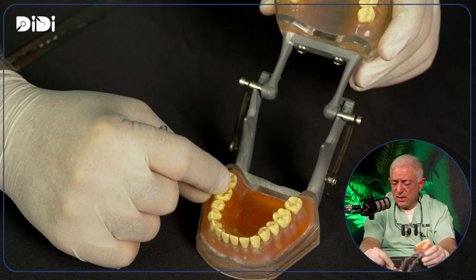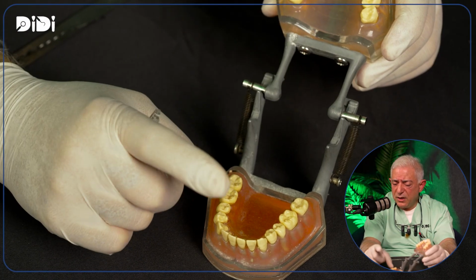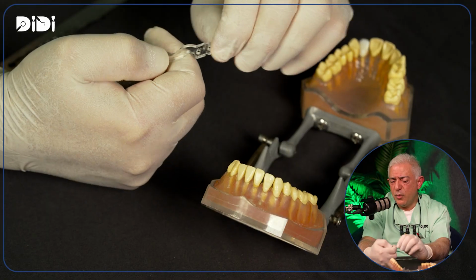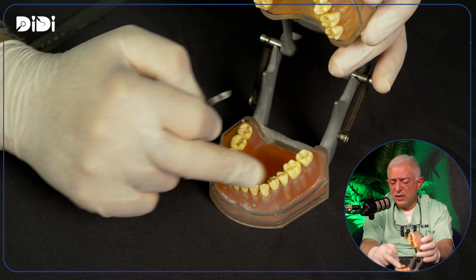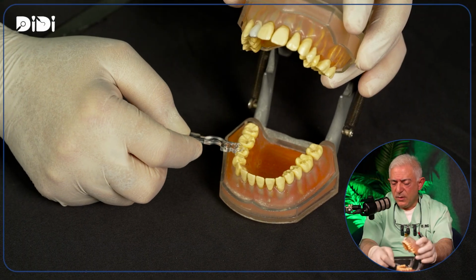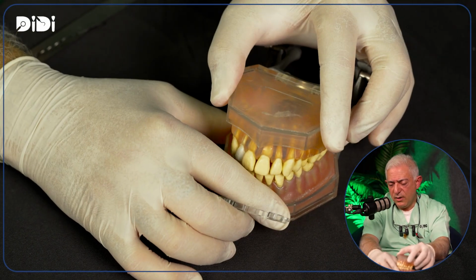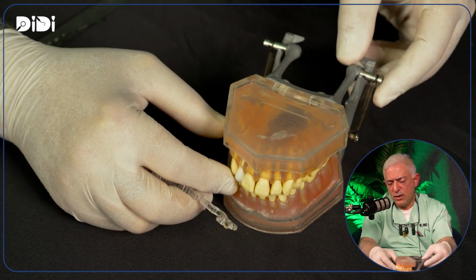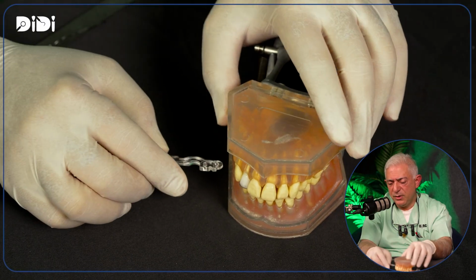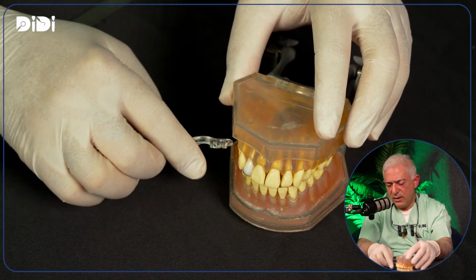If the ideal thickness is 1.5 millimeter, why make it thicker and why make it thinner? Because this tip is 1.5, if I want to increase one arch, I will use the 1.5 millimeter. Of course, I will have two DDs on both sides because I prefer to not push the condyles. I'll keep two DDs. I'll use the 1.5 millimeter. I'll place it in the premolar area, not in the back, not in the front, in the premolar area.